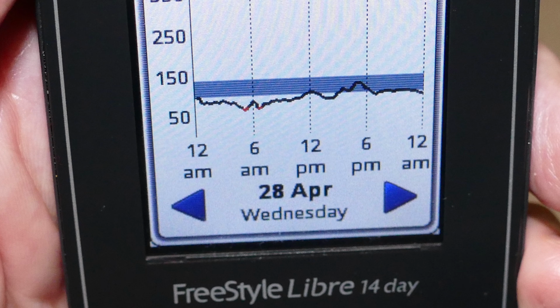It continued to drift up somewhat until it hits around 12, and then it starts to go slightly down. Now, I almost never eat at 12, so the 12 mark does not mean I had a meal then. Some people think of lunch as noon, but I never eat at noon, almost never, unless I have something where I have to leave in a hurry.